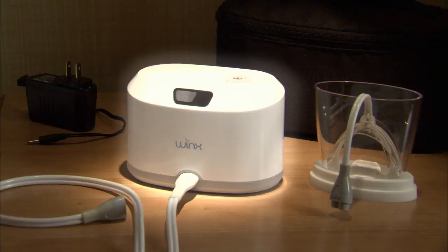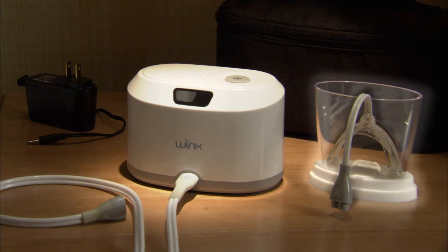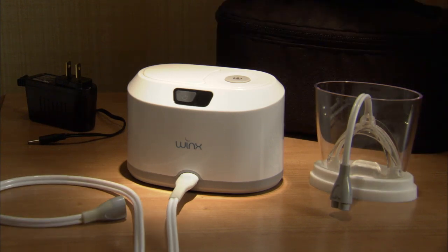The Winx System includes a console, power cord, tubing, mouthpiece, mouthpiece holder, and soft case. The main components are the console, mouthpiece, and tubing.